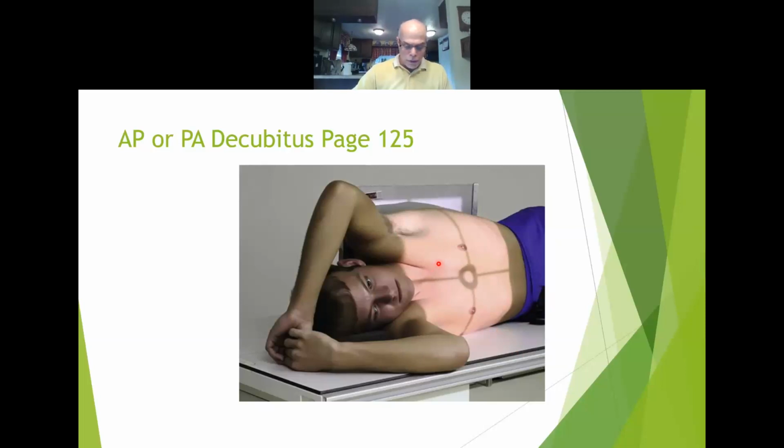Exercise care to ensure that the patient does not fall off the cart. If the cart is used, lock all wheels. That's if you're doing this in the ER and you're keeping them on the bed, which is how I would be doing this, at the vertical with the patient on a bed, scooting them all the way to the side and using the Bucky tray instead of this setup here.